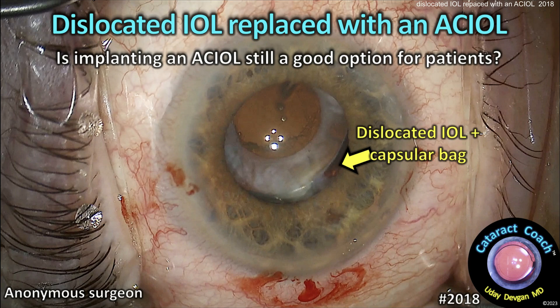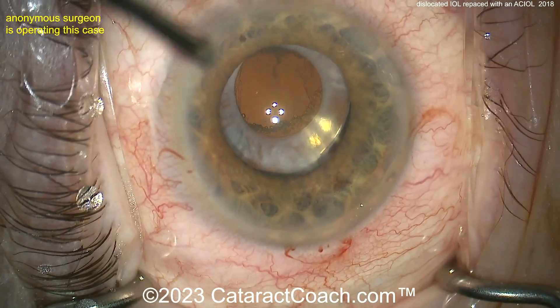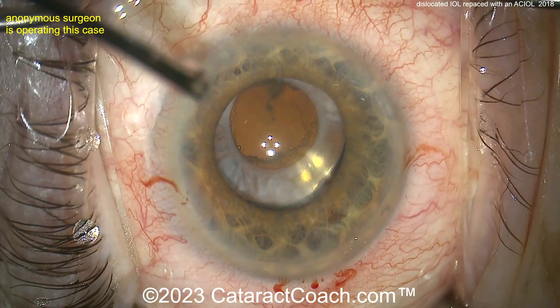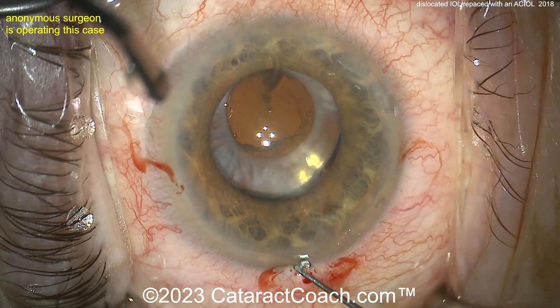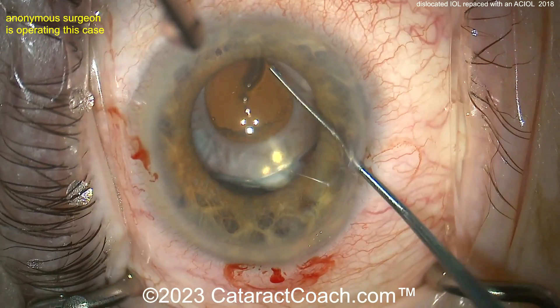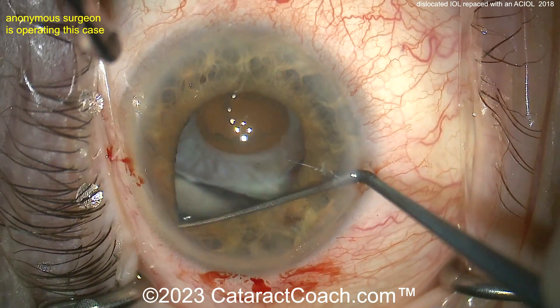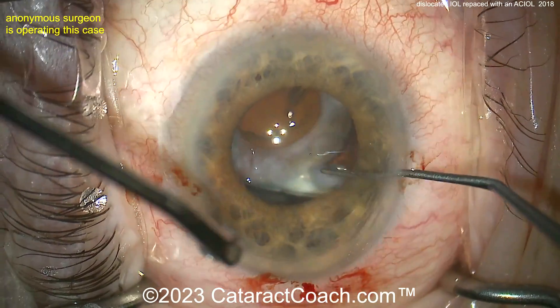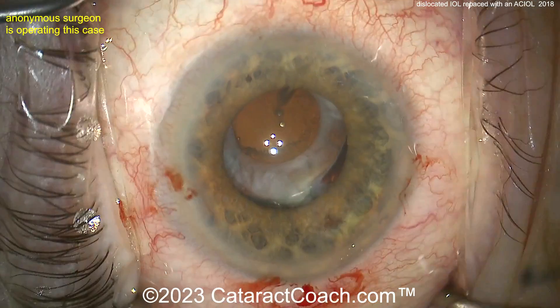cataractcoach.com: dislocated IOL replaced with an AC IOL — is implanting an anterior chamber IOL still a good option? An anonymous surgeon is operating. Look at that capsule phimosis. When you have this bad capsule phimosis, it can really cause all the zonular support to just erode away as that capsule keeps contracting and wrapping down, pulling on that zonular support.